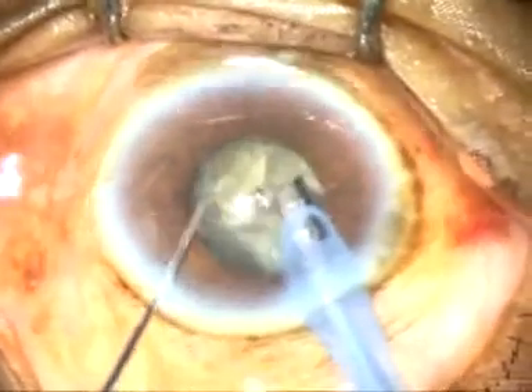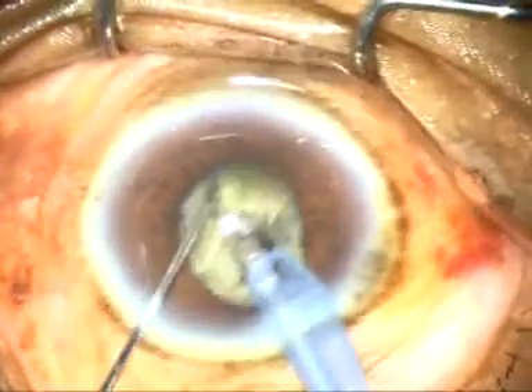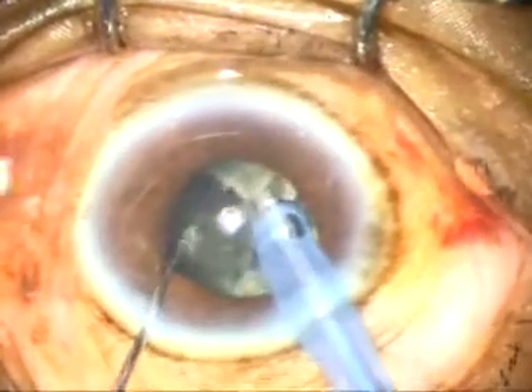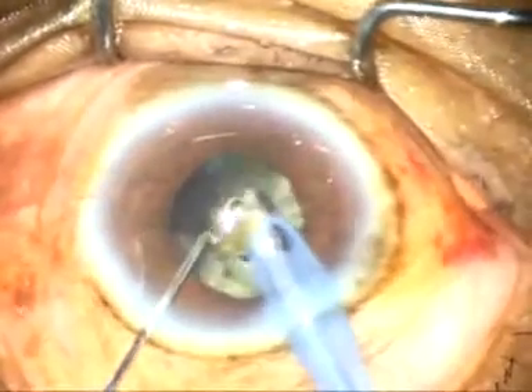This is one hemi-nucleus and this is the other hemi-nucleus — hold it and chop it. You can see vertical chop in this case very nicely. Now each nuclear fragment is to be removed. At this time the pupil has become smaller — probably it is 3.5 millimeters now.